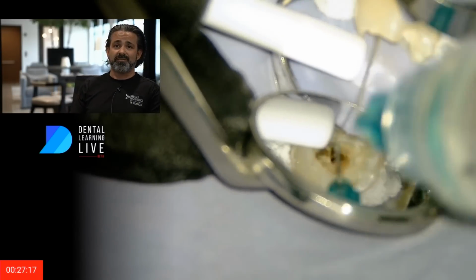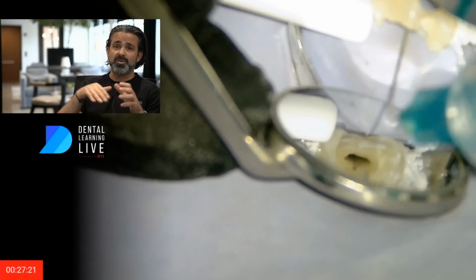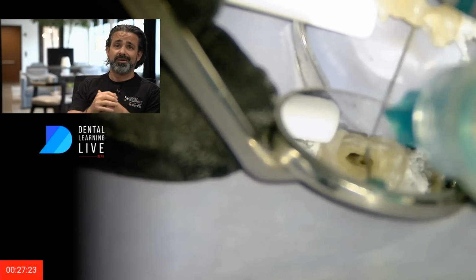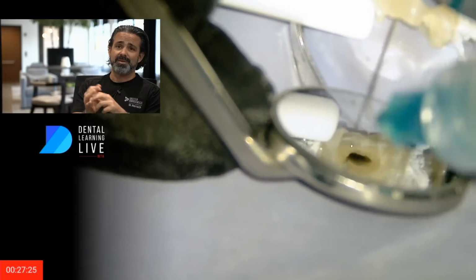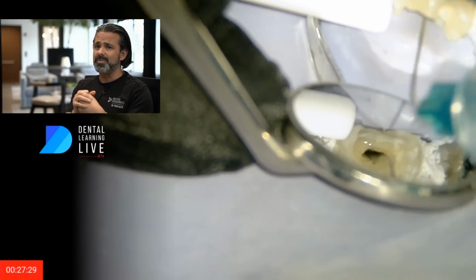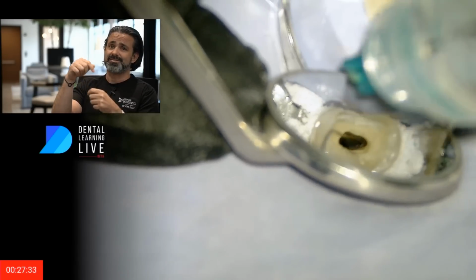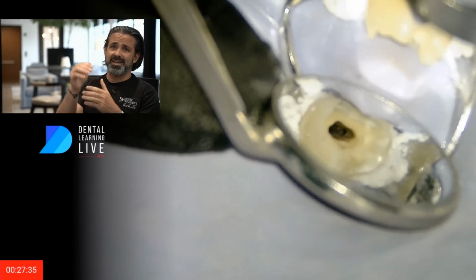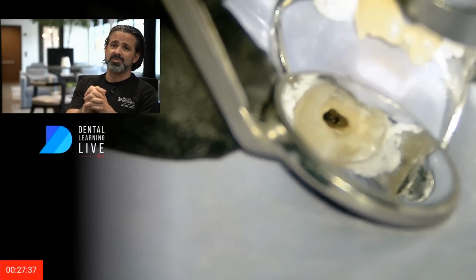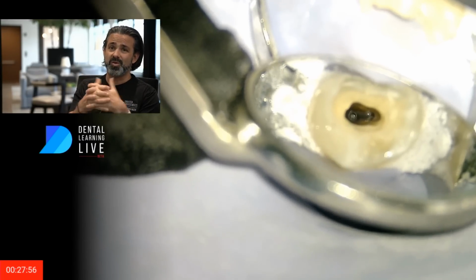I mean, that kind of confirms that, and the bleeding confirms that fluid got there, even though my materials can't, whether that be my file or even the gutta percha cone. And it would be really hard for me to try to place a 15 cone in there and just pre-bend it and get it to slide right in, because it was sort of an amorphous shape beyond that point. At least that's what it felt like.